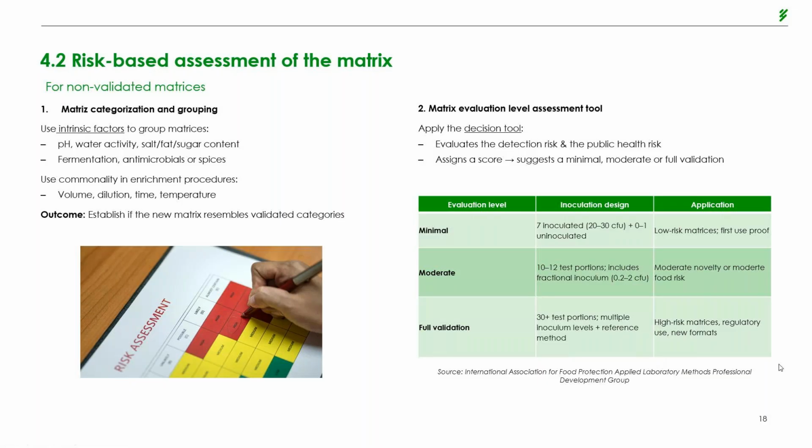This suggests whether the type of validation required should be minimal, moderate, or if you should just do a full-on validation. This tool is based on the risk to the consumer versus the risk of failure of detection of a pathogen. Right now, we're just talking about Listeria mono.